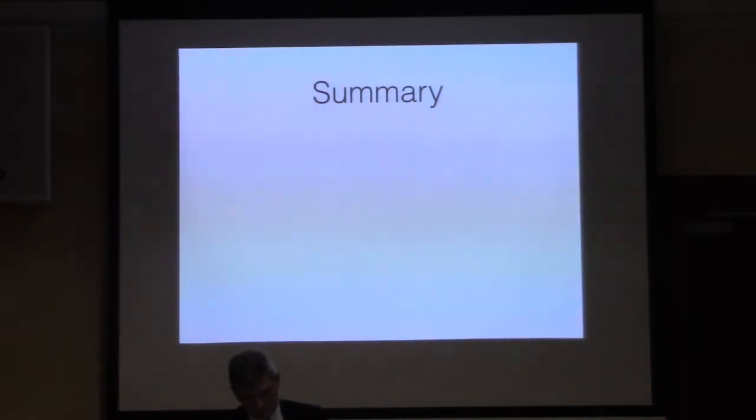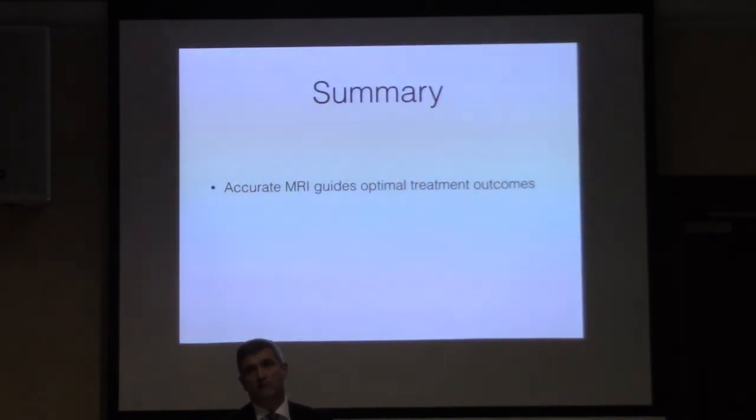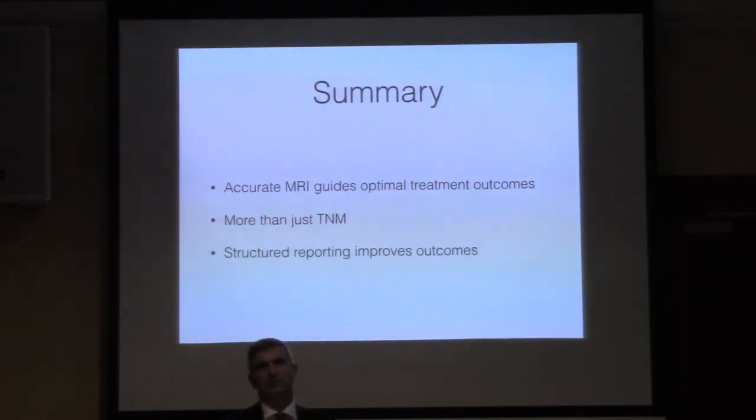So, MRI, done well, reported well, allows us to get the optimal information to allow the best outcomes for treatment options. And hopefully you've appreciated from this that it's not just TNM. There's a lot of other aspects which need to be included, which are vital to guiding which treatment path they're going to do. And if you follow a structured report, it will allow you to consistently, reproducibly get all that information recorded.